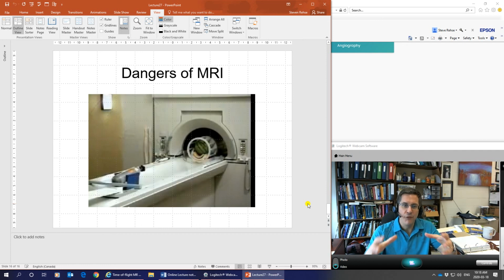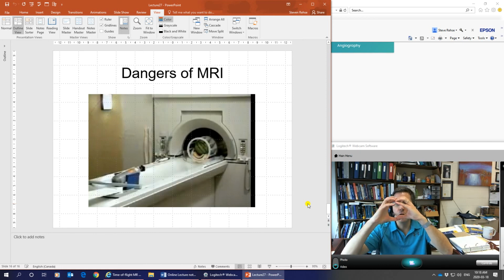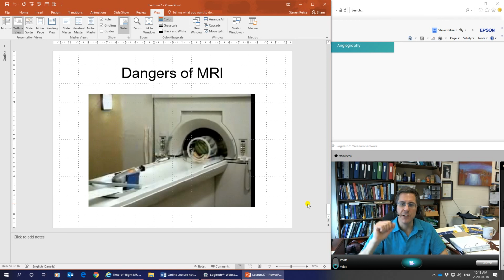So there's actually a huge amount of force on all these gradient coils because they just don't want that field coming on, off, on, off. And the idea is flux is dB/dt, a change in current, and when you put it through a loop of anything, there's an induced current in there, and that induced current can be bad. So these dB/dt's can interact with the body's electrochemistry. Some MR patients have experienced hallucinations, tastes, a tapping sound inside their brain, smells. And this is because it does interact with the electrochemistry, and your brain is mostly electrochemistry, so that's bad.